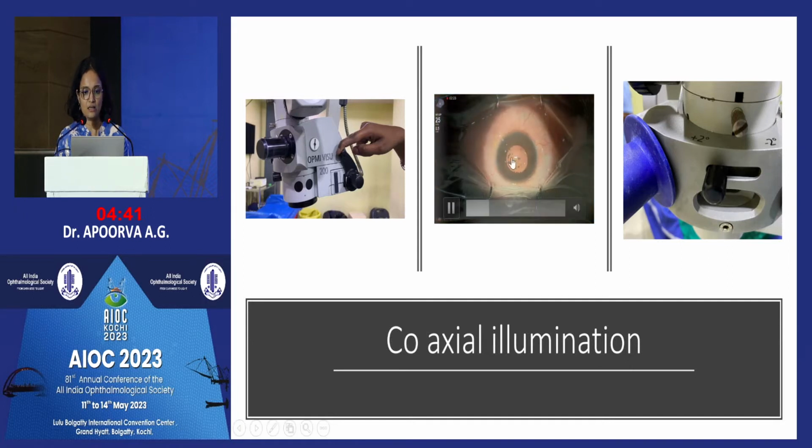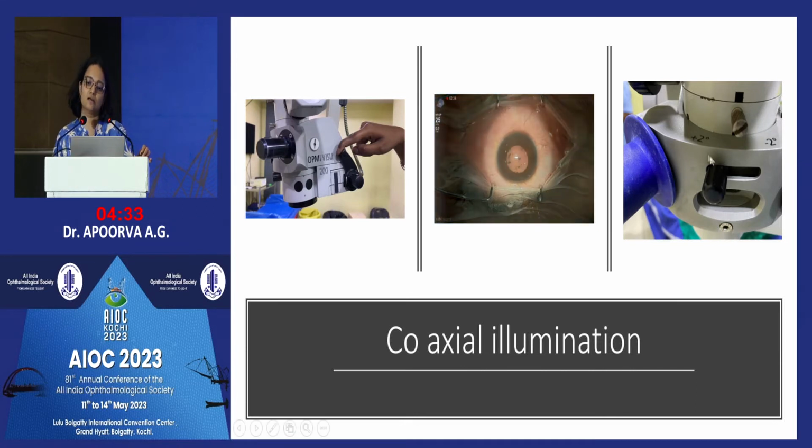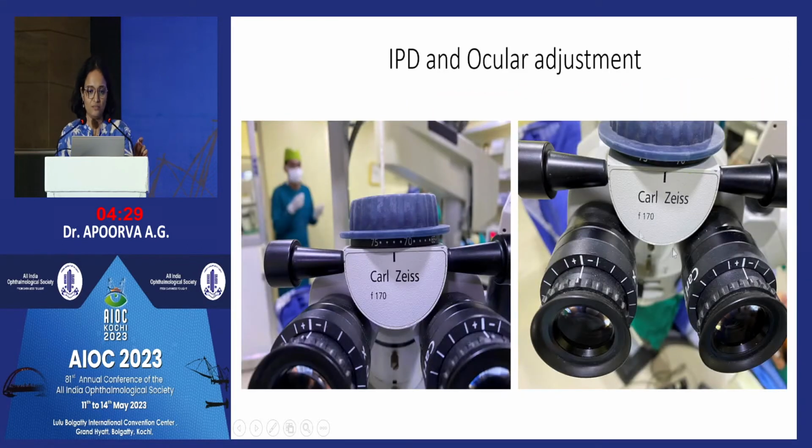And this is, like I said, the coaxial with the surrounding light. There is one more feature where it is exclusively retro. And this is the aperture, which is adjustable from +2 to -2 degrees. Now let's look at the interpupillary distance.